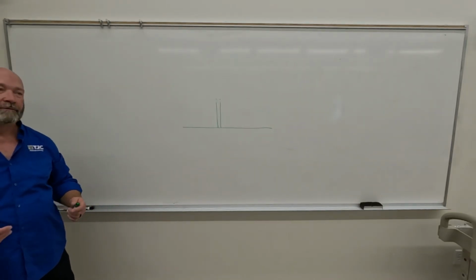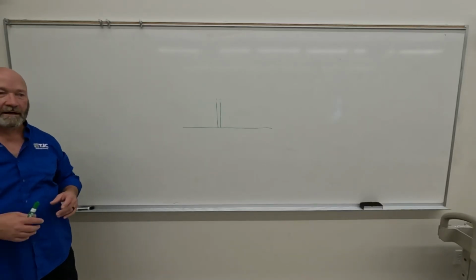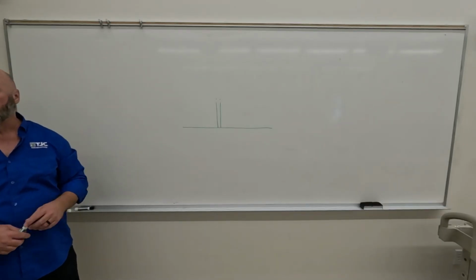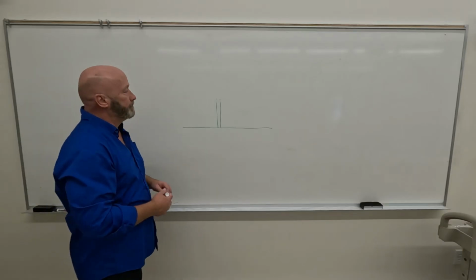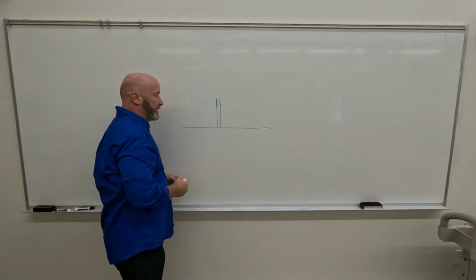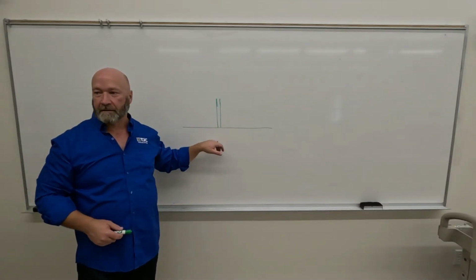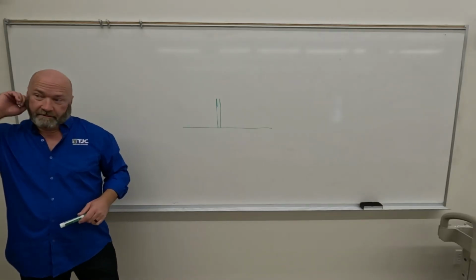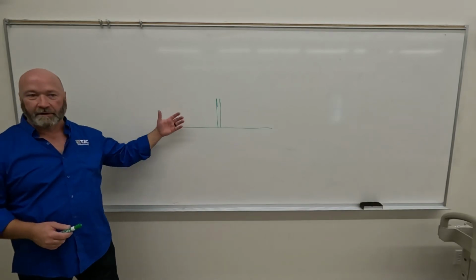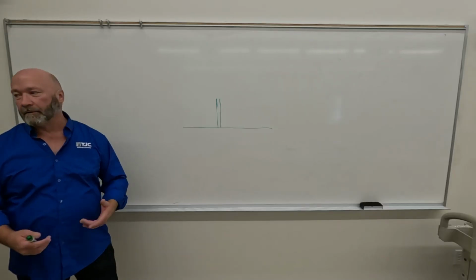So if you were to have that as your primary x-ray unit inside of a hospital, you'd have a hard time doing surgical lateral hips, things like that. It just wouldn't work well. Okay. This is what we used to have over in Pirtle, and the other thing with it is that our system over there would jump the track sometimes. So students moving the x-ray tube, and all of a sudden you hear a crash and it jumped the track and it fell over. So we had to pick it back up, put it on track. So that's a little unstable, right?